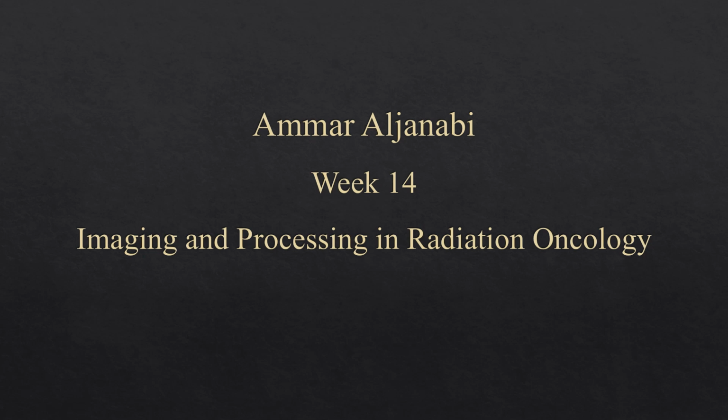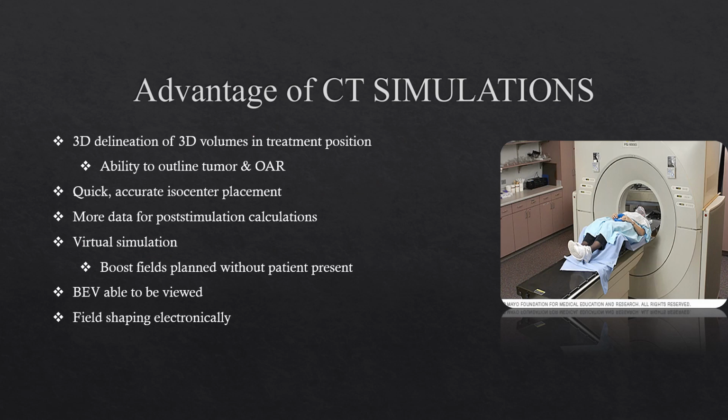Okay, the week assigned to present is week 14 for imaging and processing in radiation oncology. Let's get started. The first section of week 14 is the benefit, or advantage, of CT simulation.